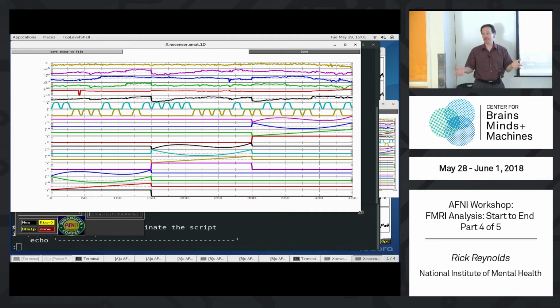A lot of people have done analyses like resting state. They tell you how to process the data. You should remove time points with motion and have a lot of tissue regressors and whatnot. If they had accounted for all their degrees of freedom, they were publishing in the negatives, which is to say having 150 time points but 160 degrees of freedom used up with regressors.